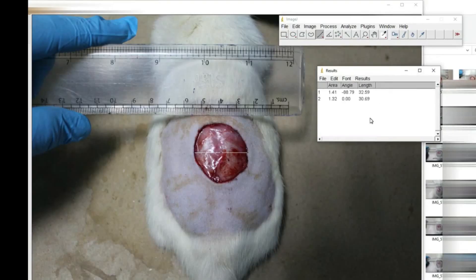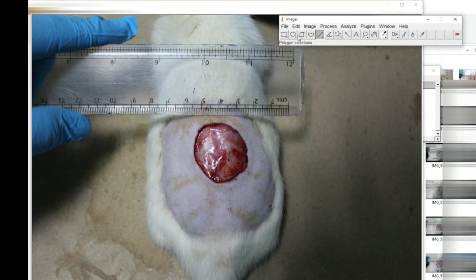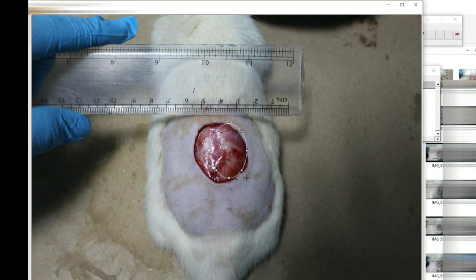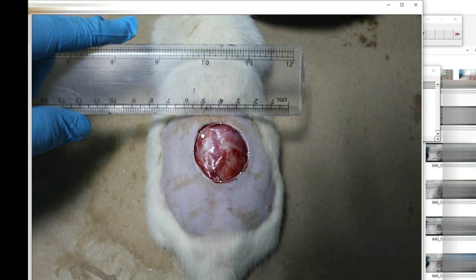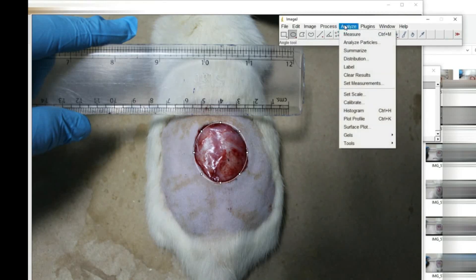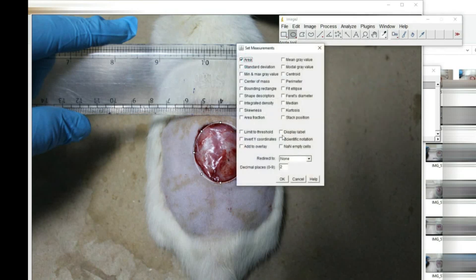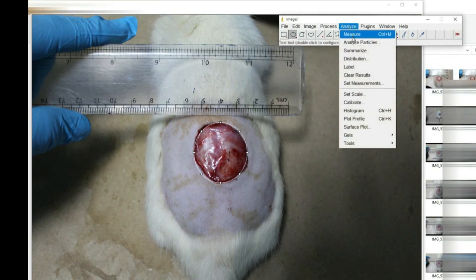To verify whether the length and width readings are correct, we will use another tool in the image software — the circular option — and place it completely over the wound area. This gives an approximate area of the wound. To check if our length and width area calculation is accurate, we go to the Analysis option, set the measurement to area only, click OK, and measure the area.